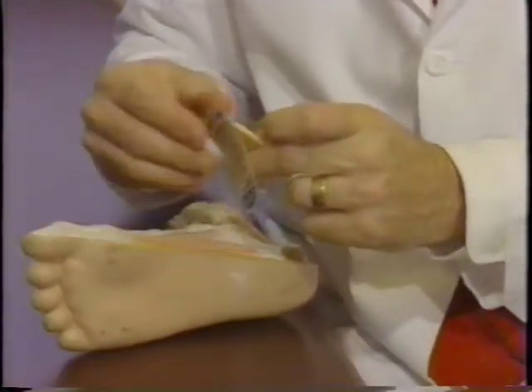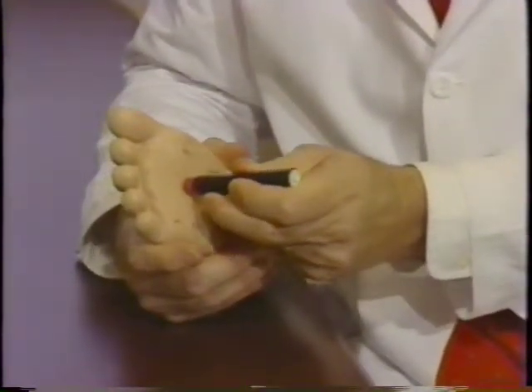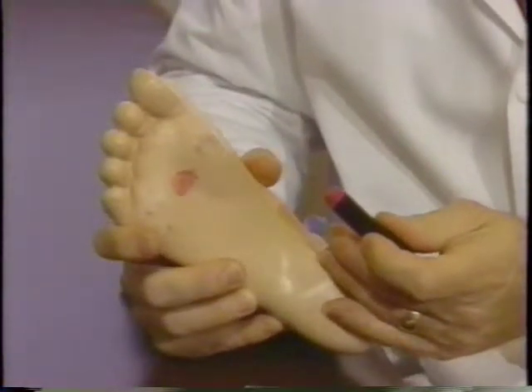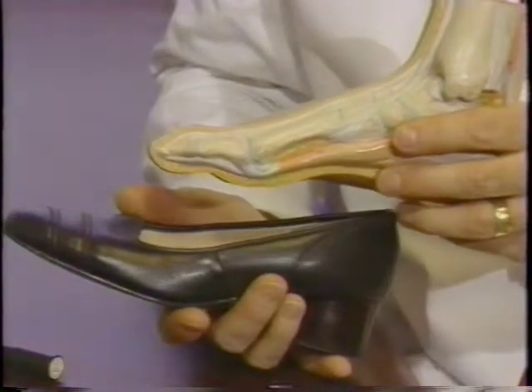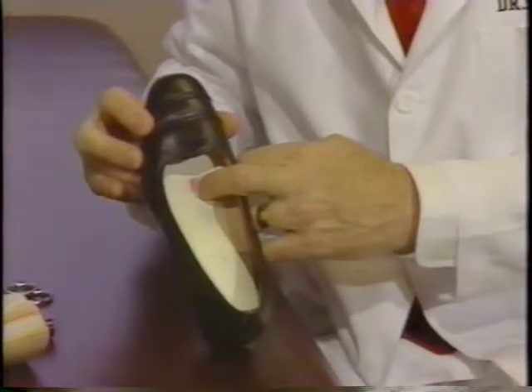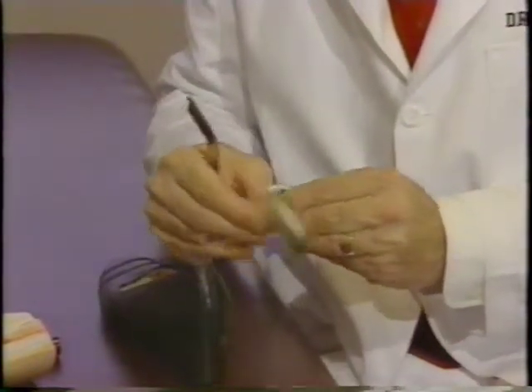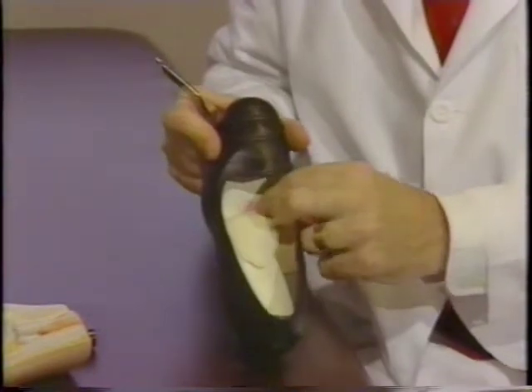A trick I sometimes use to help a patient figure out where to place that pad is to use some lipstick. Have them make a very thick mark with lipstick on the bottom of their foot where the painful area is. Then they carefully slip their foot into the shoe, step down, and leave a mark on the insole. Once you've marked the insole for the problem area you wish to relieve, if you're sure the mark is in the right place and you've used these pads before, you can merely stick the pad in the shoe just a little bit back from the mark.